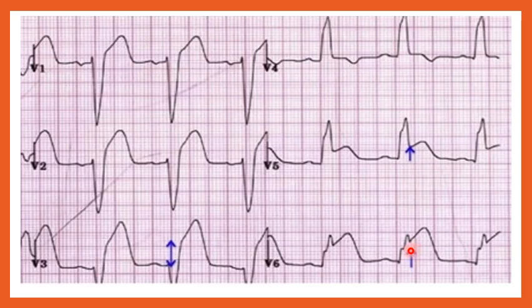Now what we've got going on here, look at those little blue markings there. We can see ST segment elevation. So it looks like we have left bundle branch block according to the configuration of the QRSs in V1 and V6 in the face of an ST elevation MI, in the face of a STEMI, right?